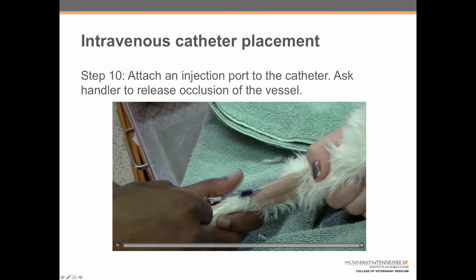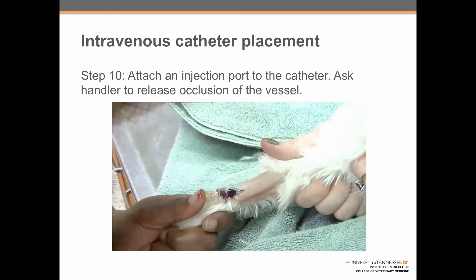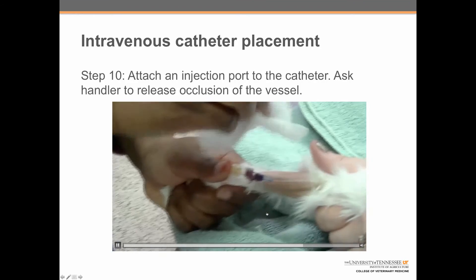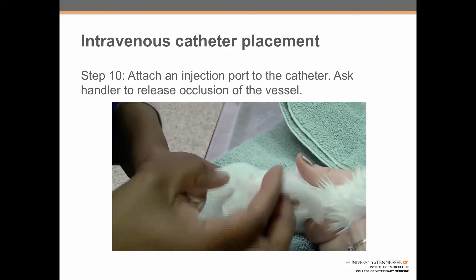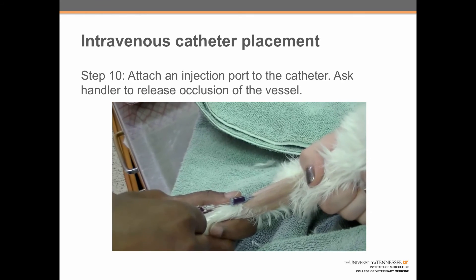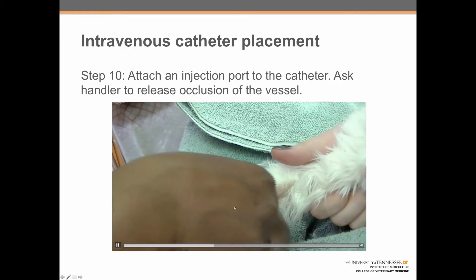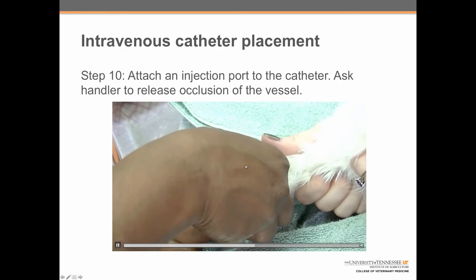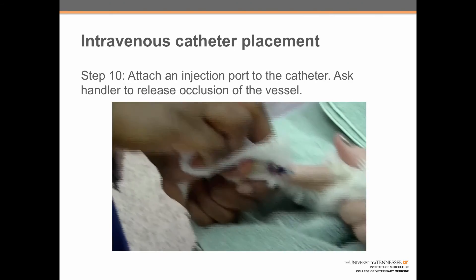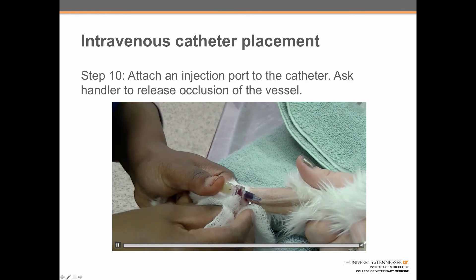Step 10 has two parts done simultaneously. It's important to put an injection port on the catheter as soon as the stylet is taken out, so you don't end up with blood everywhere. At the same time, ask your handler to release the occlusion of the vessel so that excess blood does not come out the hub. Shanna screwed the port on while the handler was releasing occlusion. She uses her thumb against the hub, not applying too much pressure so it doesn't pop out, but keeping it straight onto the vessel so the catheter is not lost.